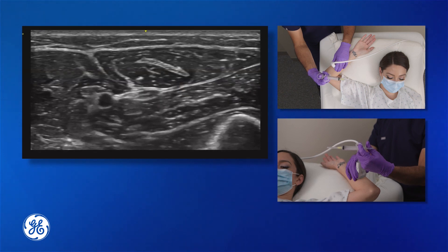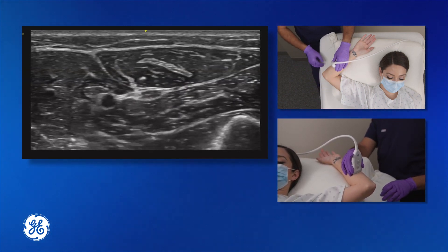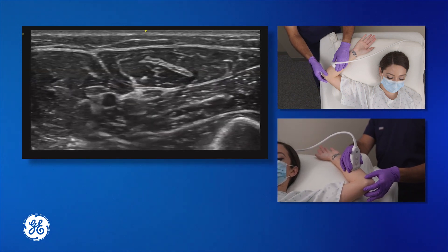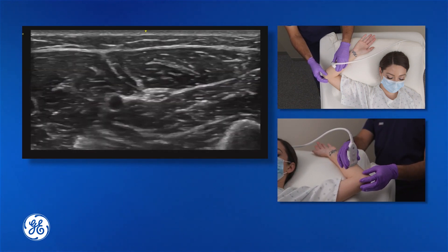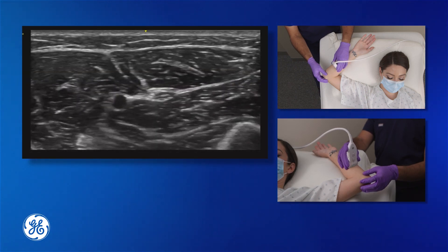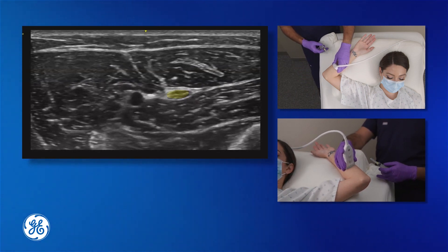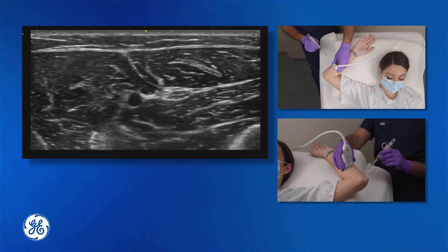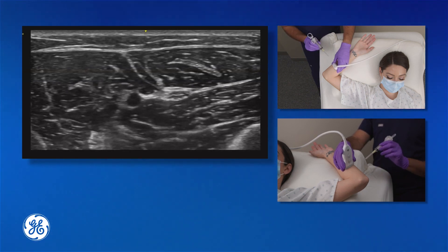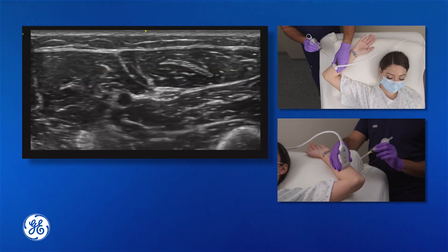The positioning of the arm here is above the patient's head, to allow for easy access to perform the block. When positioned like this, the nerve can be visualized cross-sectionally and the needle can be introduced. We like to do the needling here on an in-plane approach with a cross-sectional view of the nerve. This allows for easy visualization of the needle as it approaches the nerve.